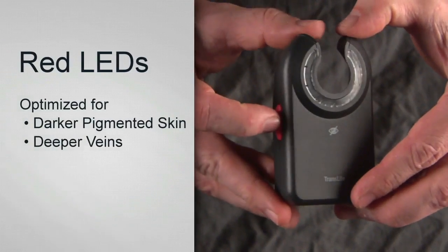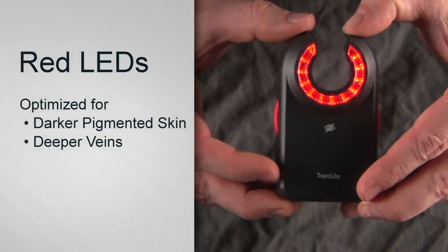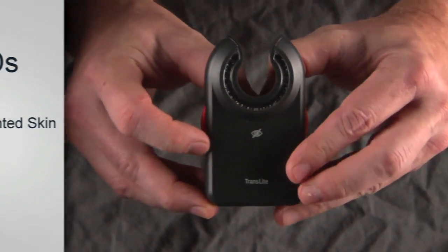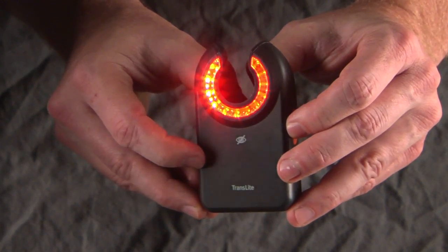When the red button is pressed, red LEDs will light up, which are optimized for darker pigmented skin and deeper veins. Press the red button again to turn off. You can also activate both the orange and red LEDs if a higher contrast is needed for vein illumination.